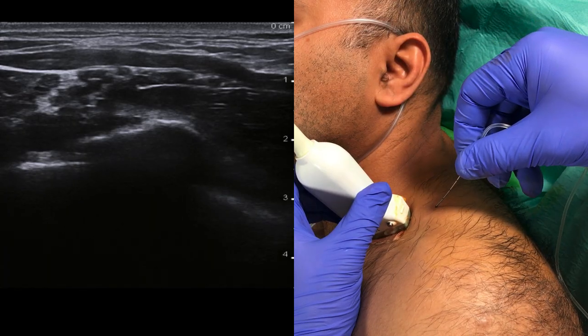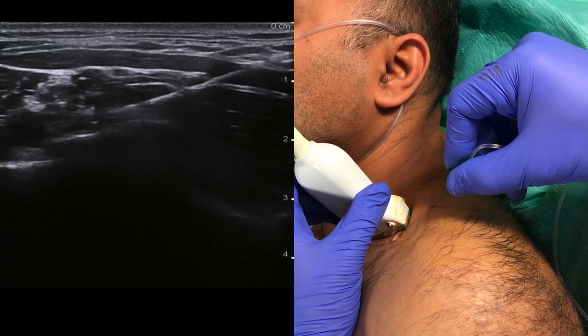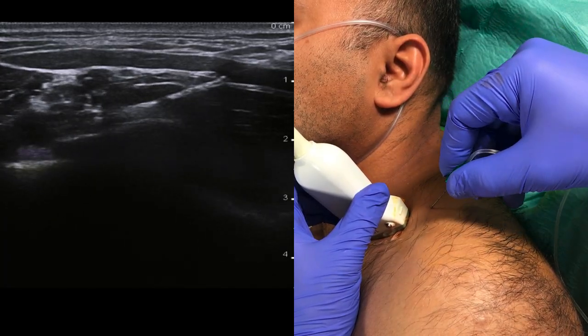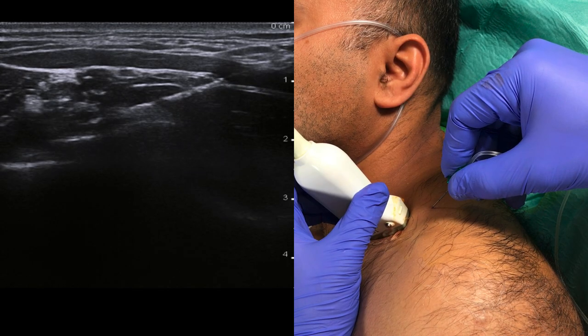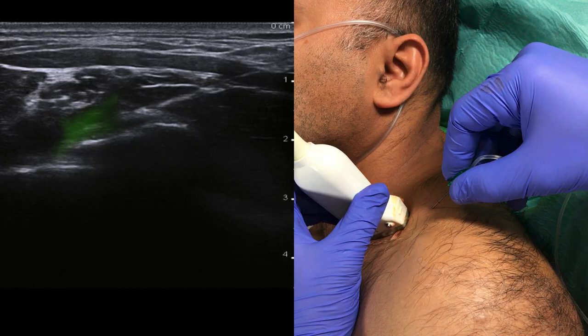Try to keep the needle visualized during the entire procedure. Start to inject local anesthetic below the artery, where the ulnar component is usually located. Once again, note the proximity of the pleura. You can see the spread of local anesthetic, which we've here marked in green. In the block that we've filmed here, the spread down to the ulnar component was actually inadequate, so we had to go back and complement it with an isolated ulnar block.